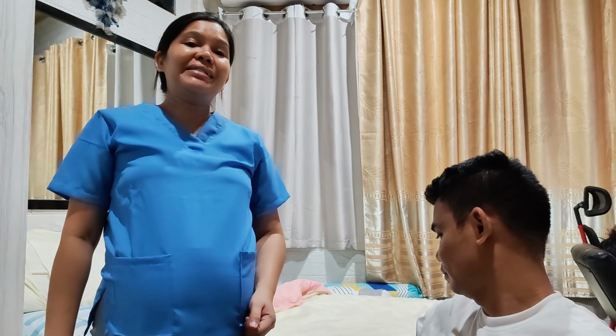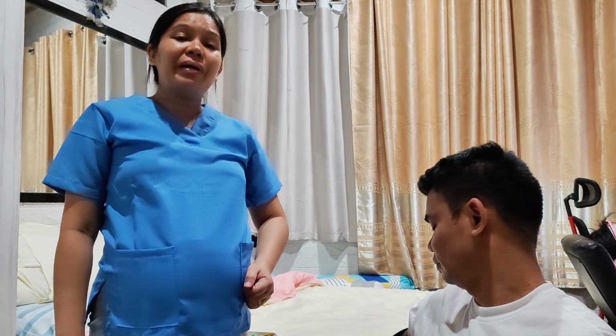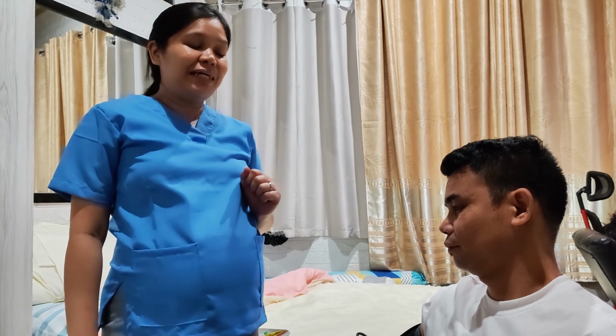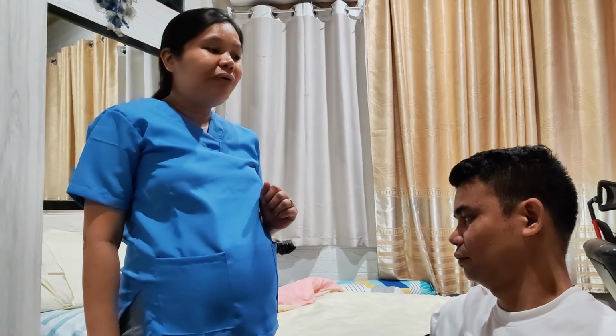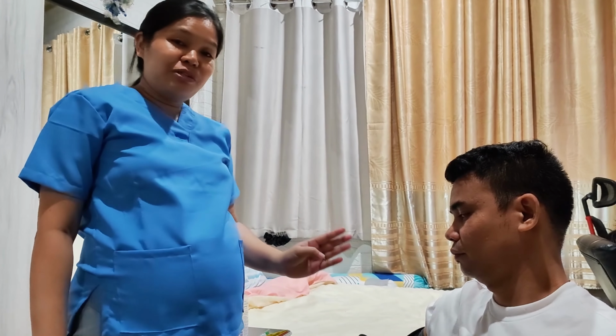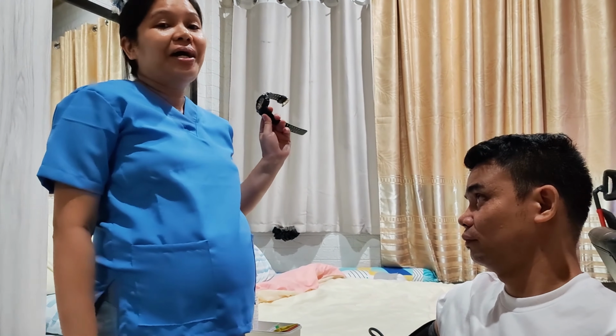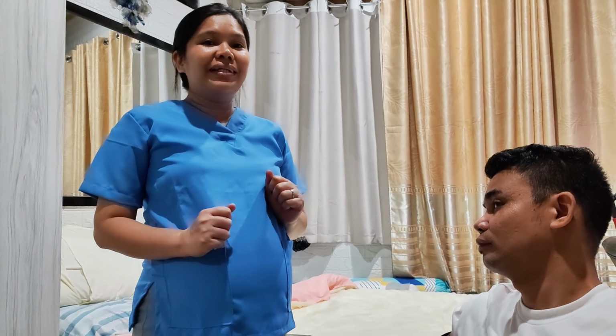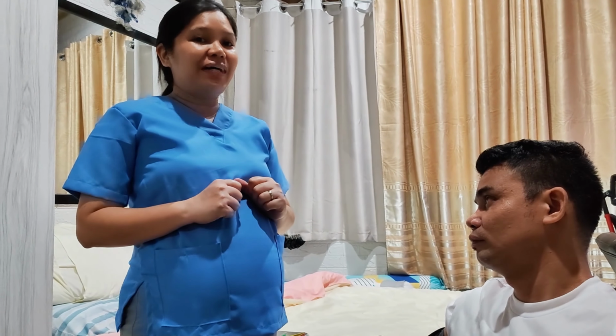So common errors in taking the vital signs of the patient will be: first, not allowing the patient to rest before taking the vital signs. Also, not using the appropriate size of the thermometer, sphygmomanometer, or miscounting the pulse rate of the patient. So always double check the equipment and the technique that we are going to use in taking the vital signs.